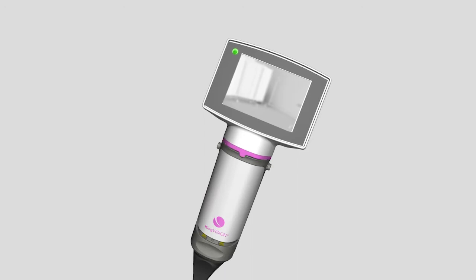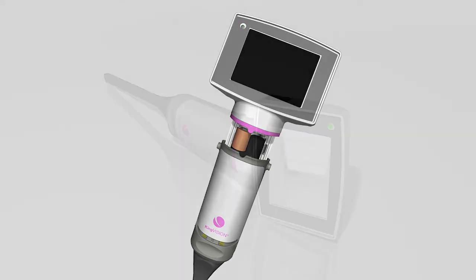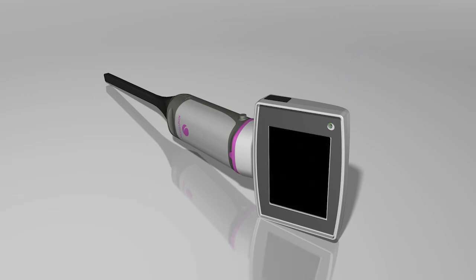If the display is turned on with no video adapter attached, it will automatically power off in 20 seconds. This automatic power down will also occur if the fully assembled KingVision video laryngoscope is left idle on a work surface for 60 seconds.